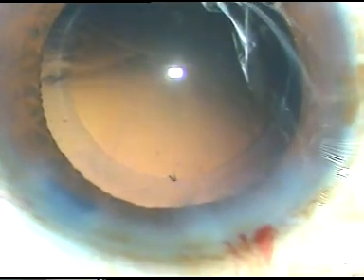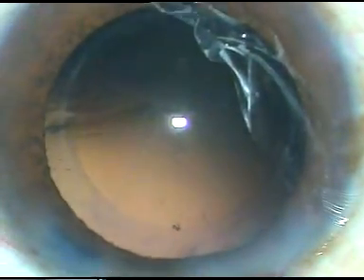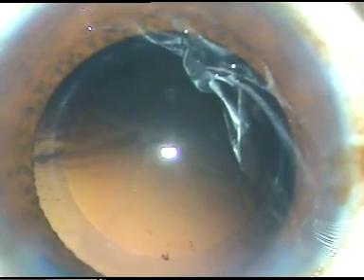Now the lens is being implanted under irrigation. This is the intraocular lens — it is a hydrophobic acrylic intraocular lens. Irrigation goes first.